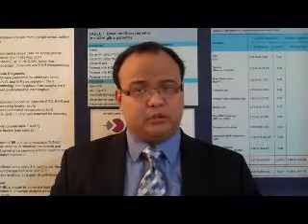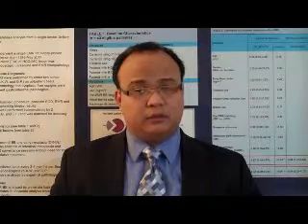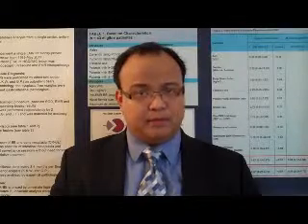and improved diagnostic accuracy. However, this imaging technique and the proposed fluorescence intensity criteria using EMR tissue will still require in vivo validation. Nevertheless, these findings support the potential of a topical fluorescent analog with CLE to enhance detection of Barrett's dysplasia.